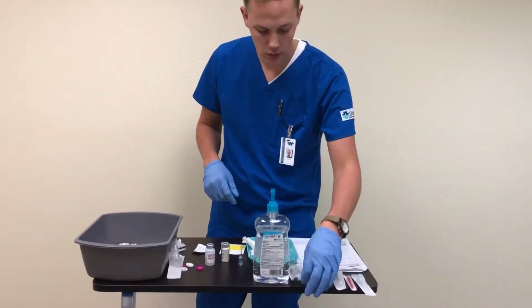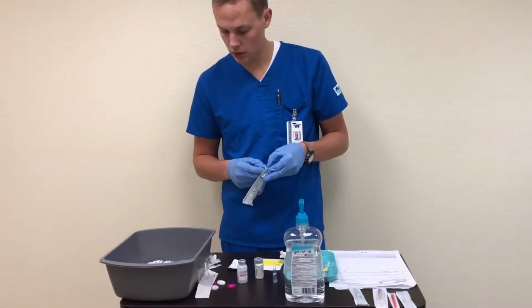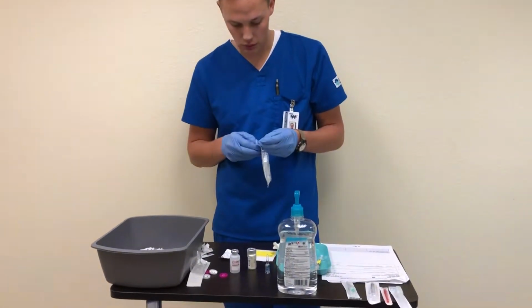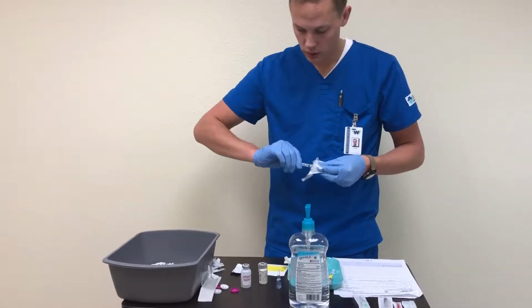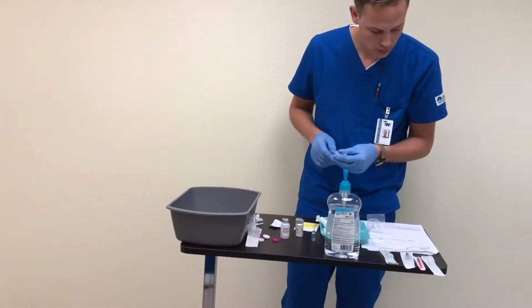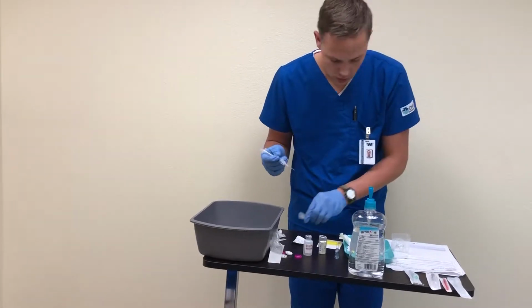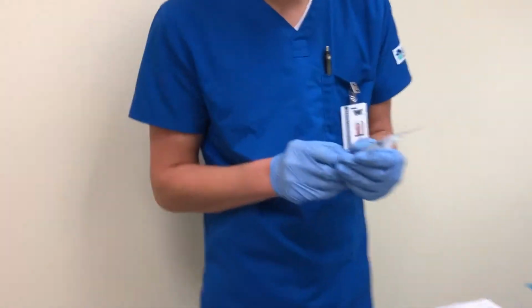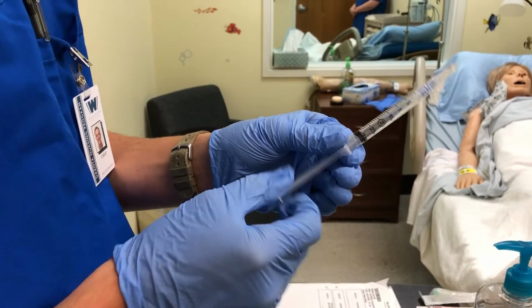So I can then start with my syringe and needle. And then this one is also the 3 mil 23 gauge. Screw that on. And pull it out. And then we're gonna do the 3 mils of air again. There's our 3 mils of air.